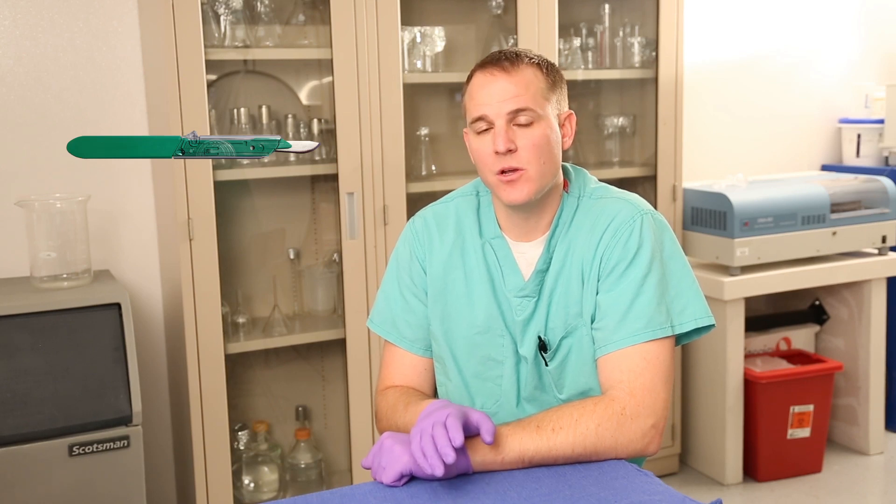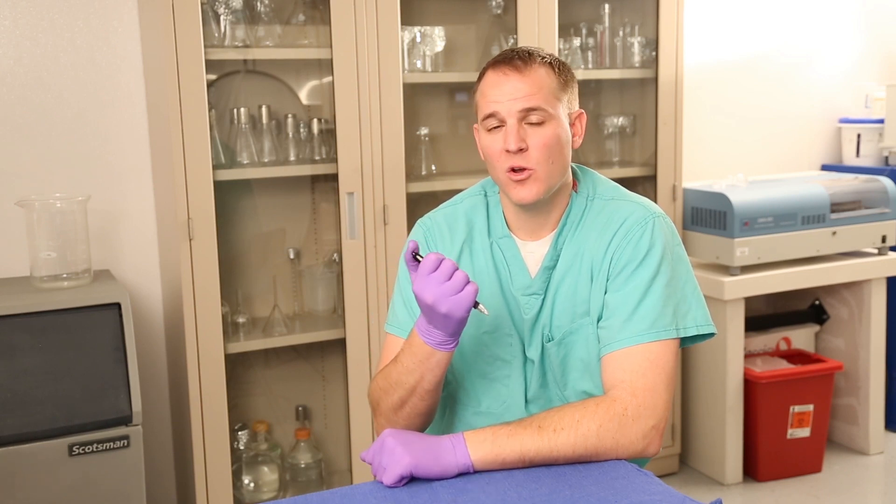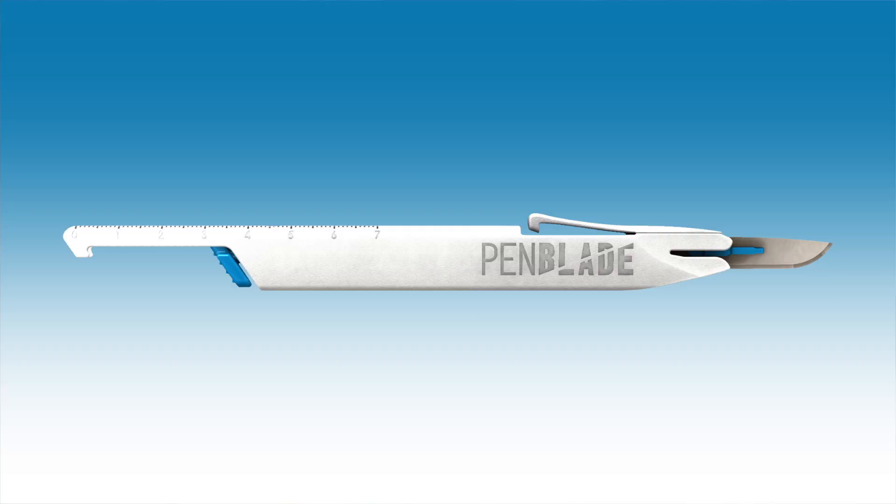When we set out to design a safety scalpel, we didn't want to do a one-off iteration of the current sheath types or box cutter types, of which there are many. We wanted something new, intuitive, and ergonomic, like this pen. We designed the PenBlade similar to this pen so that muscle memory can play a role in safety. This is the PenBlade, a novel safety scalpel with unique features that's intuitive to use.